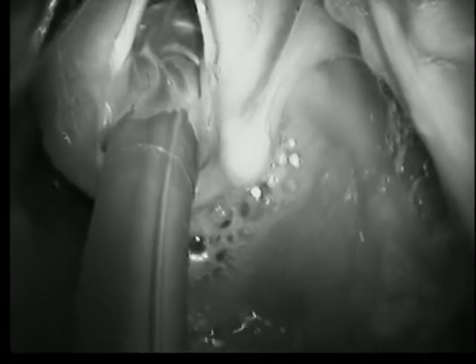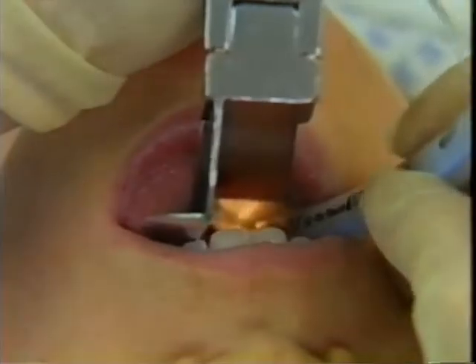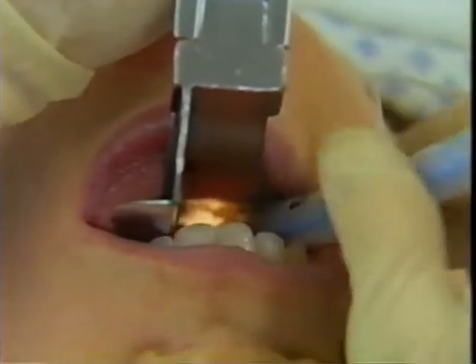While there may be a blind spot at the moment of entering the larynx, you can often see the arytenoids behind the tube. Let's watch this clip again. Notice that, as sometimes happens, the tube had to be redirected to line it up with the opening. You need to be gentle, as forcefully bumping into the larynx multiple times might cause trauma, bleeding, or swelling. Stop advancing when the cuff is beyond the cords.